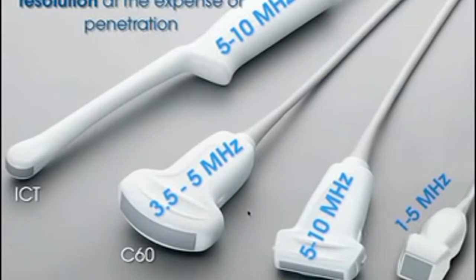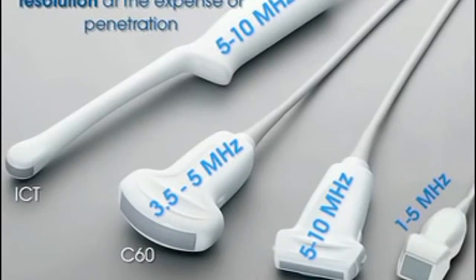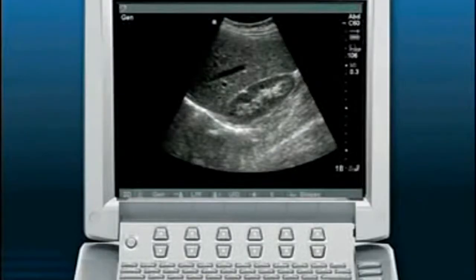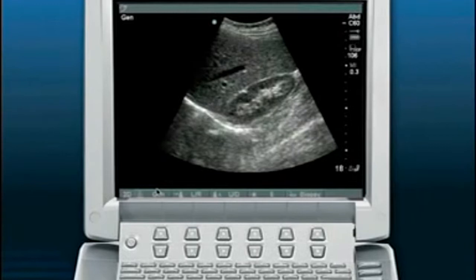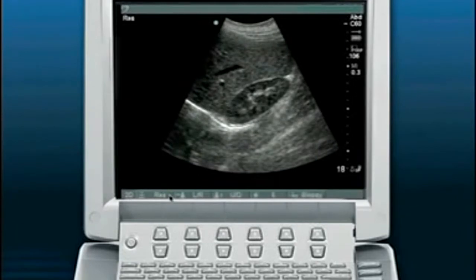Each transducer has a frequency range — for example, one goes 5 to 10 megahertz, another 3.5 to 5, another 1 to 5 megahertz. You can toggle the frequencies up or down within each transducer depending on the clinical situation. The general mode sits in the middle of the range, around 3 megahertz for a 1-to-5 transducer. Pressing the soft key toggles up to resolution mode, which is the high-frequency setting — for a 1-to-5 megahertz transducer that would be 5 megahertz — producing dots that are closer together and more resolute.